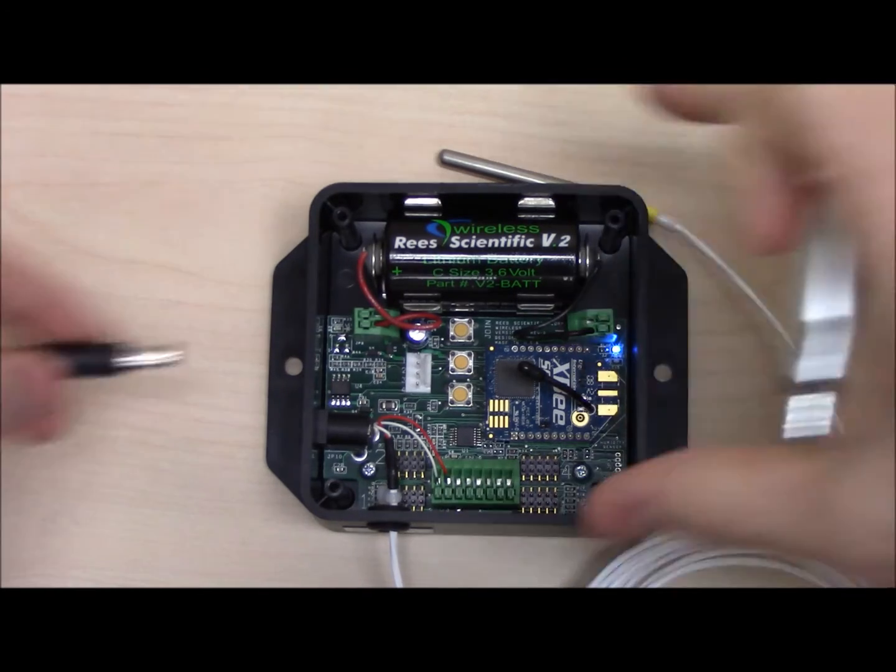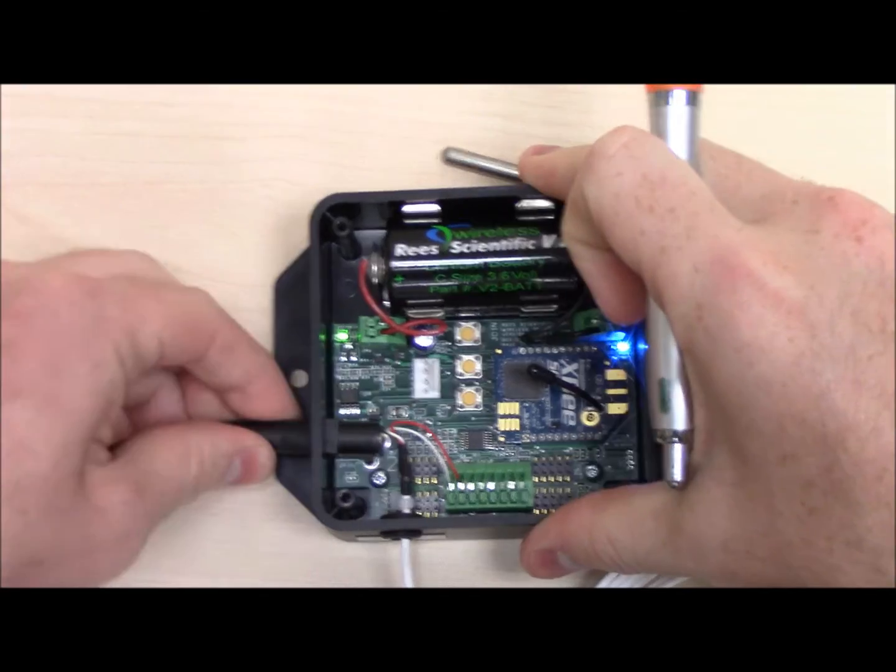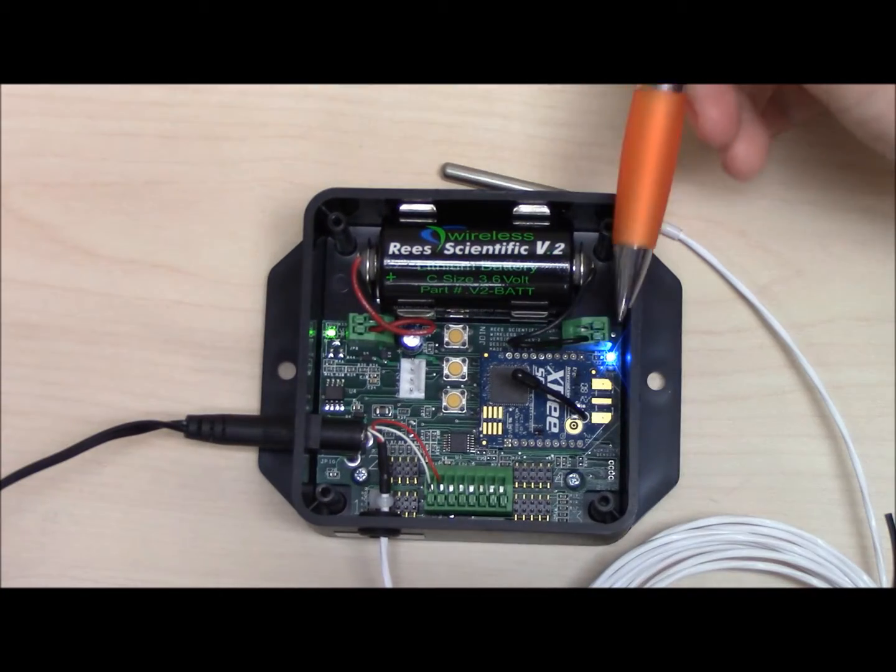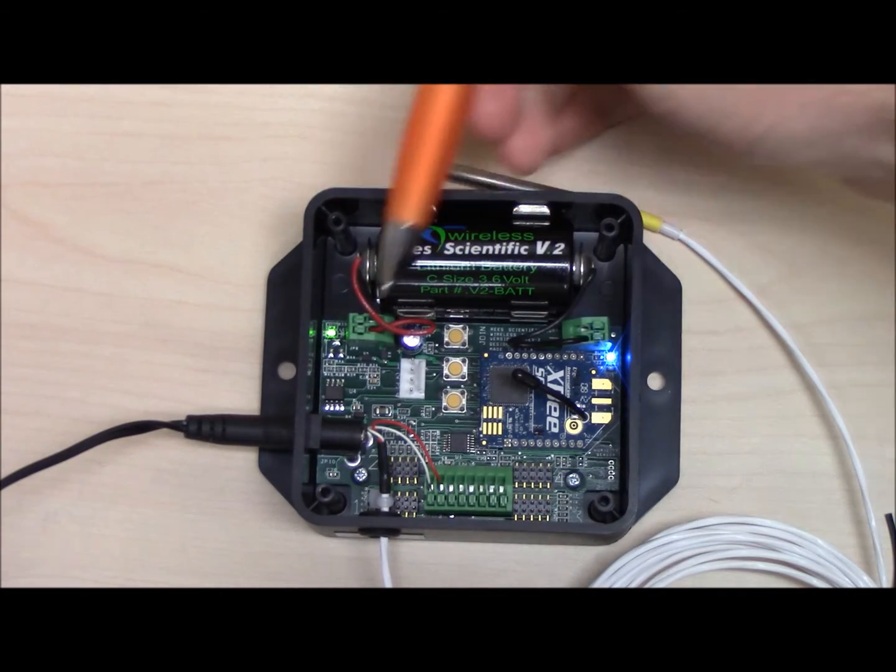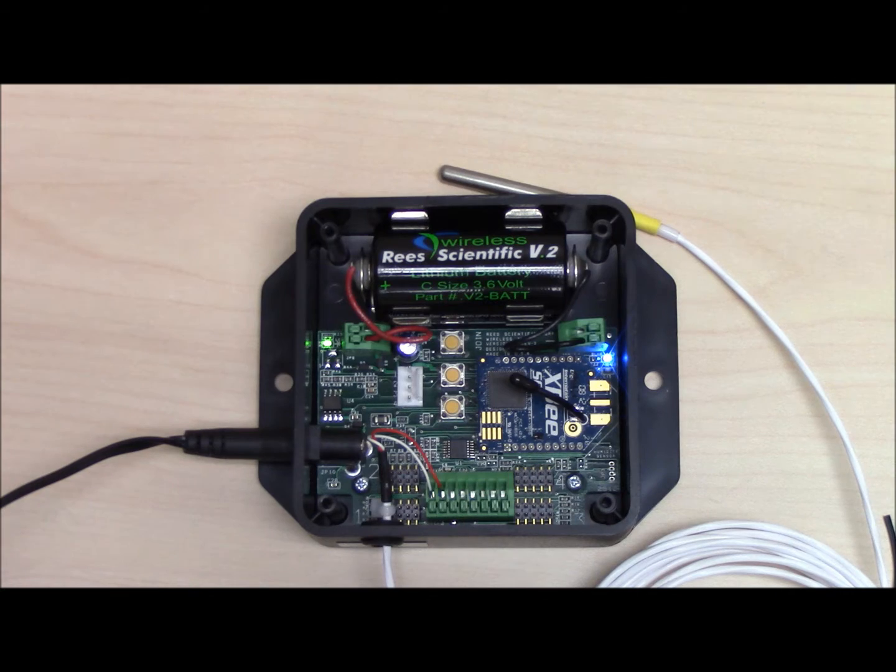Now connect the transformer to a power source and plug the other end into the power receiver. You should see both a blue and a green light. The green light will not be lit when under battery power only.